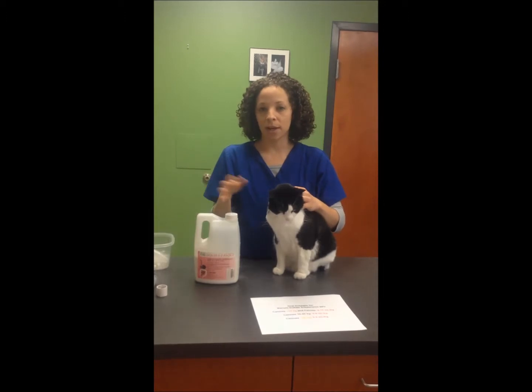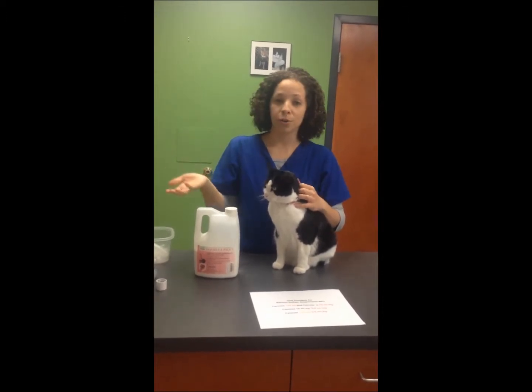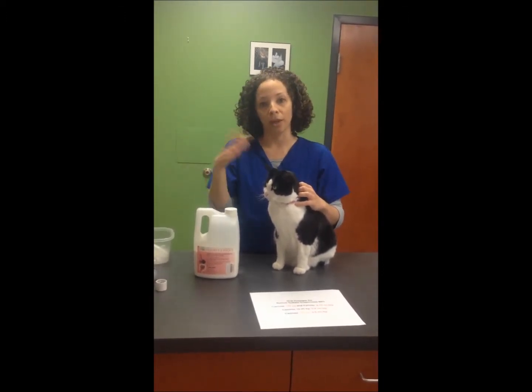But even if you still take those and you still want to proceed with the study, you'll already have your X-ray technique solidified, you'll have your positioning solidified, and you'll also have something to compare and contrast with later on.